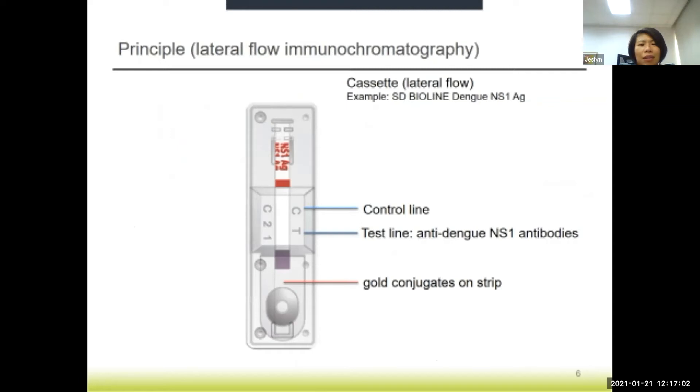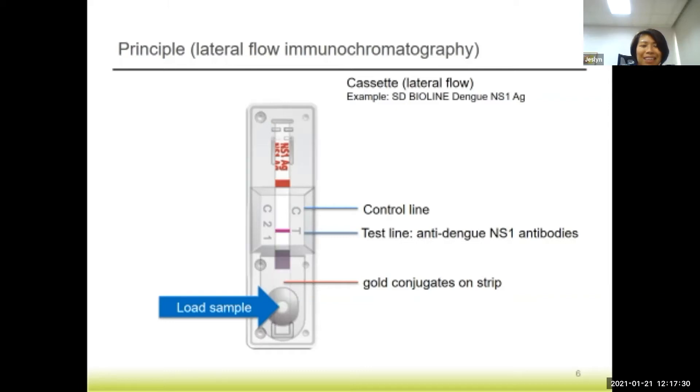The principle of this test kit is basically lateral flow immunochromatography. For example, this is an SD Bioline dengue NS1 antigen kit. The sample is loaded into the sample well at the bottom and it will flow through the cassette. When it flows through the test line and the control line, if there is any dengue NS1 antigen present in the sample, a test line will appear where T is indicated. The control line must also appear to validate the test kit.